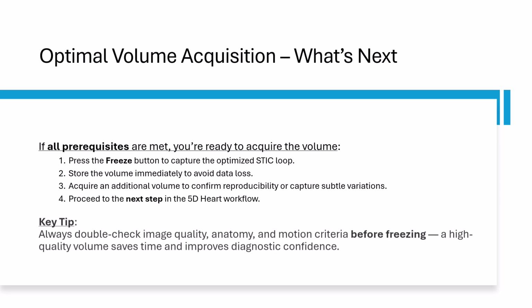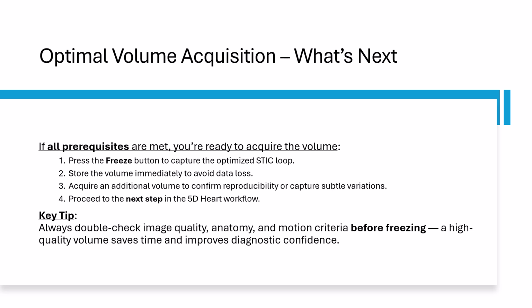Key tips: always double check the image quality, anatomy, and the motion criteria before freezing. Capturing a high quality volume saves time and enhances our diagnostic confidence.